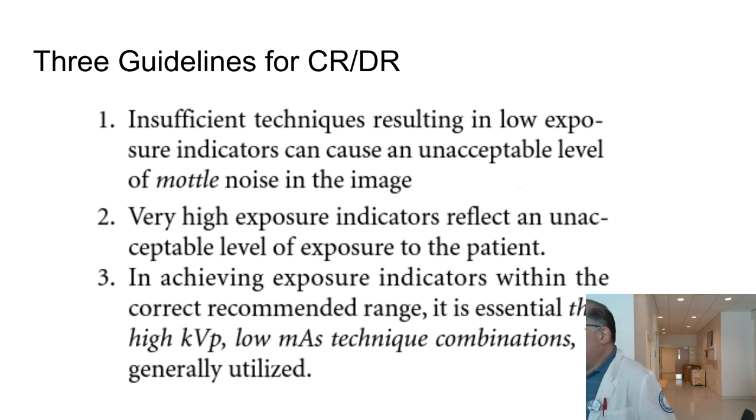We've learned that we would get noise in our system, right? And that you could recognize. But an overexposure is hard to figure out, right? Because when you look at the image, it looks good. Even when you use 10 times the amount that you should have used, unless you have a very excessively high exposure, leading to what's known as saturation, and I'll try to show you what that looks like. Only then will you get a visible cue that causes you to step back and say, wow, we overexposed the patient, no good, right? But chances are you don't see that because you have to be way, way off, right?